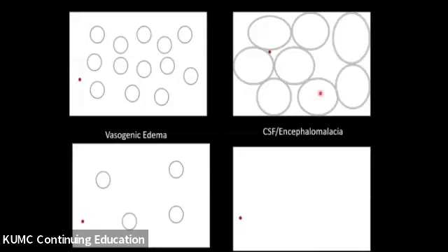in different intracranial environments. So for those purposes, in these little pictures I have, we're going to imagine that these little gray circles are the cells or neurons, and outside of that, we have an extracellular interstitial fluid space. And these little red dots, not my laser pointer, but the other dots, these are the protons. So not to scale, but that doesn't matter for these purposes. In the normal brain, there is diffusion occurring in the extracellular interstitial fluid space. It is not great, as we can see, but it is nevertheless occurring.